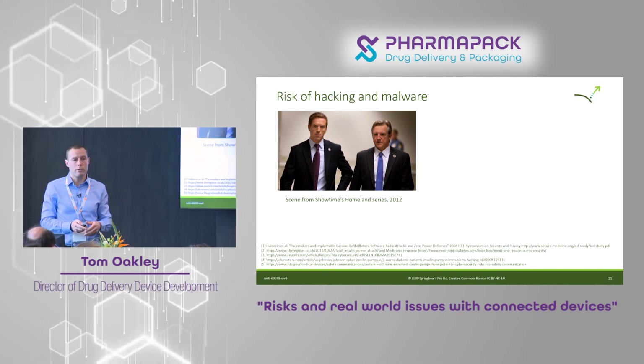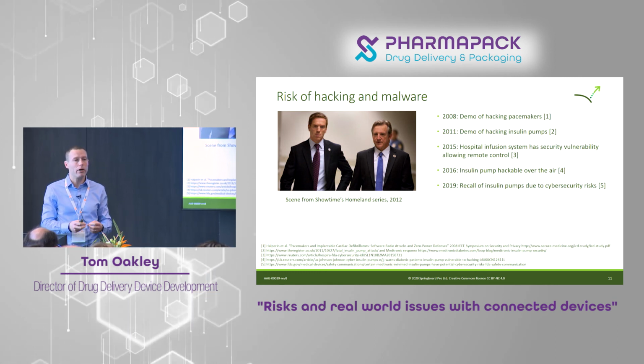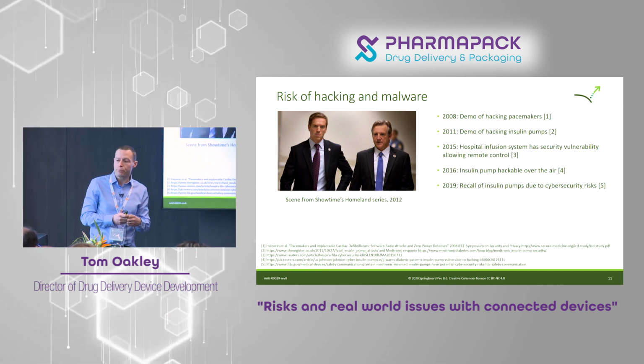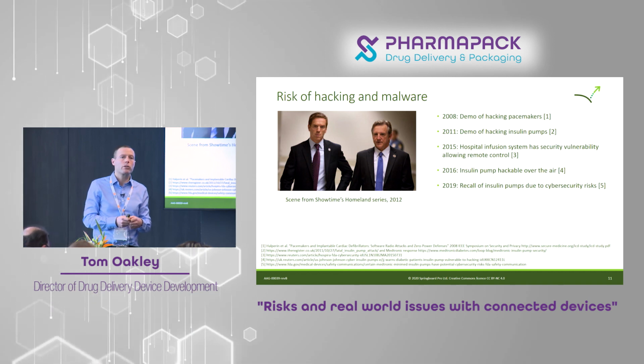This was in 2012, and in 2008, a real-world demo of hacking the pacemaker was shown. You can do it. It's a real-world case. In that case, to give you an example, it was to do with the encryption keys that are allowed.